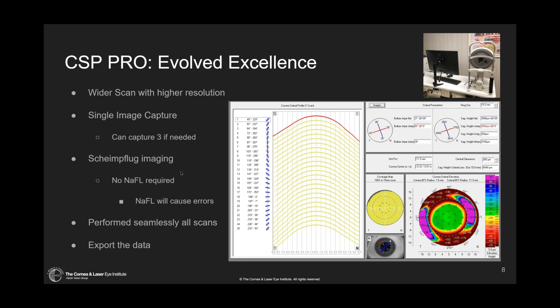We can get all of this while the patient is sitting in front of the device. The wavefront aberrometry gives you baseline autorefraction, while optical biometry gives you axial length baselines — very important for myopia management, which should be everyone at this point. Being able to capture all the data you need about the cornea and the CSP scans flows seamlessly into the way it's performed in the office.